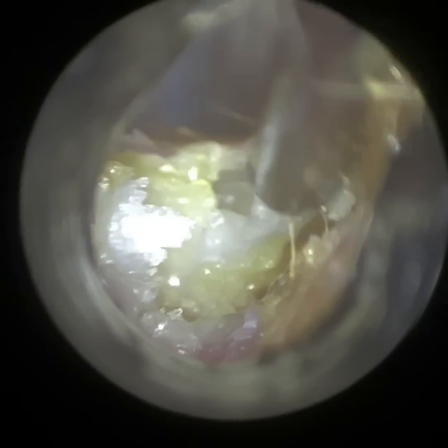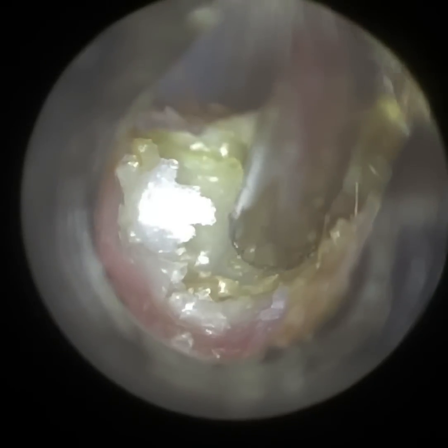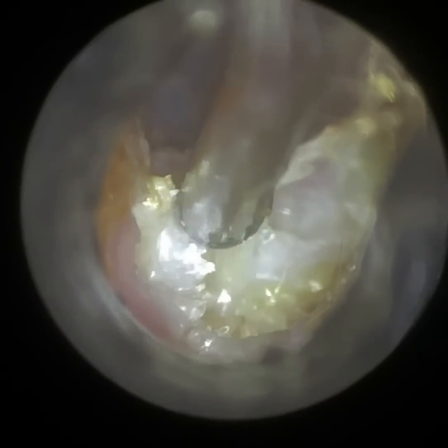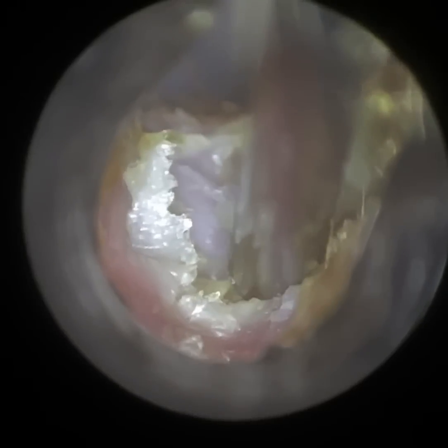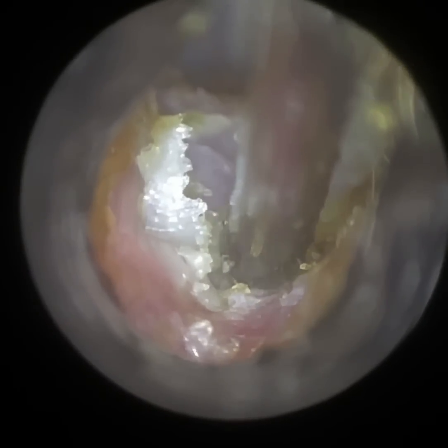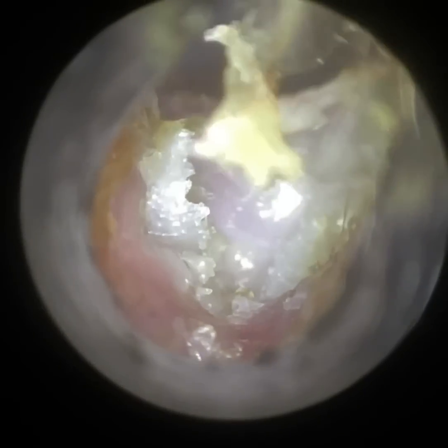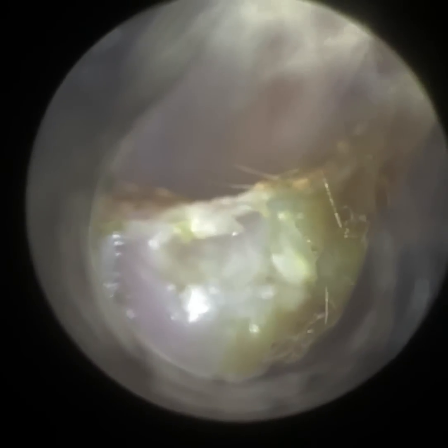An ENT microscope and an endoscope are the two gold standard methods of wax removal. But an ENT microscope weighs a ton, it's very expensive, and it takes a high level of training to use. The Waxscope, compared to the microscope I've got, I would say in terms of wax removal it's the equivalent, if not slightly better. I'm trying to say all this without being biased — of course I have commercial interest, I've developed the Waxscope. But if I'm being really objective, I really do feel that, and I'm really confident in what we've achieved here.